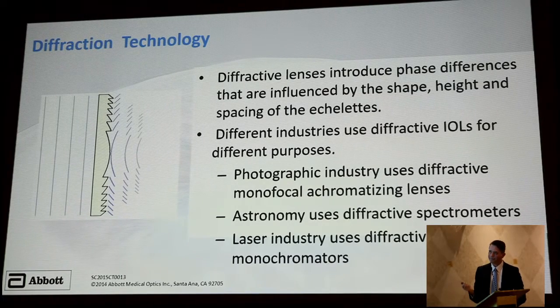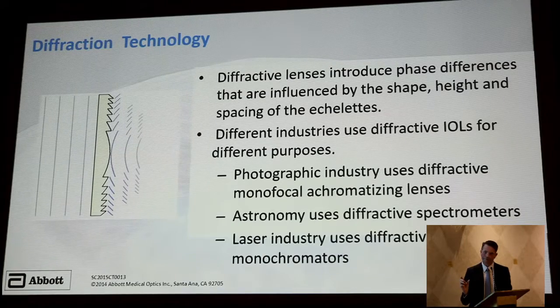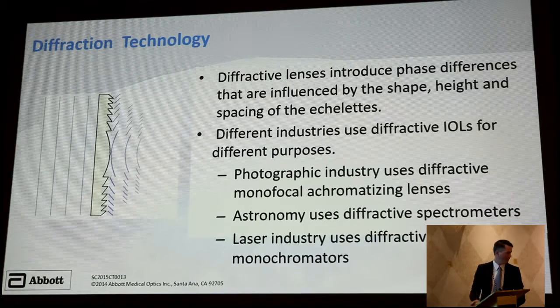So they basically took a lens, and I counted these one day. I think the original AMO multifocal had 32 rings, so their diffractive pattern was 32. And the Symphony is about 9 or 10. So they went from a 3-to-1 reduction in the number of rings and increased the spacing. They also changed the height and the shape here. It's not actually a straight-up step, it's a slightly curved step. All of that had the effect of creating this depth of focus instead of point focus. And that's the magic of this design.